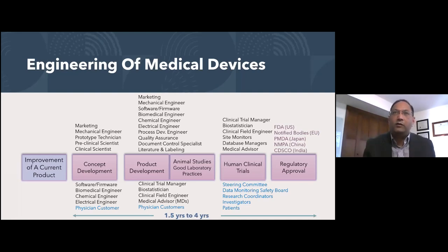One small use on an individualized basis is how is the patient breathing? How is the patient's heart sound changing, right? Mm-hmm. You use some of that information to make predictive work. Say, hey, the heart failure is progressing in this person, so we need to adjust the drugs, or we need to adjust the timing of the device. So that's one individualized area of predictive therapy that you can do.